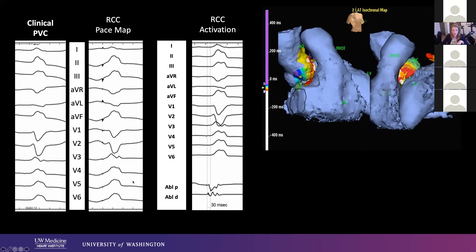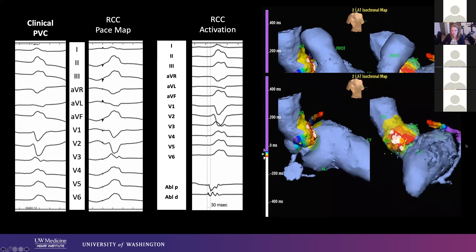This was the clinical PVC in the lab. This was pace mapping from the right cusp — a 97% match in modern verbiage. You can see that all the nooks and crannies are in the correct direction, and even the more isoelectric leads are matching up. I find those isoelectric leads get switched very easily if you're not in the right spot. My distal ablation signal was 30 milliseconds out in front. I mapped the great cardiac vein as well — we were reasonably early in the GCV, but earlier in that right cusp. And ablation in the cusp eliminated the PVC.